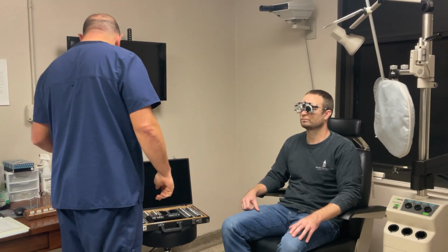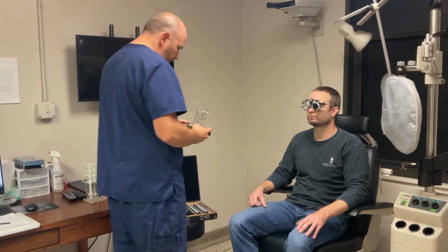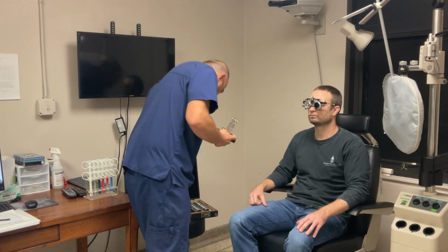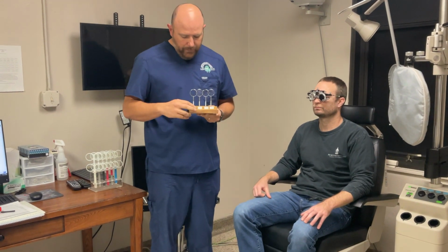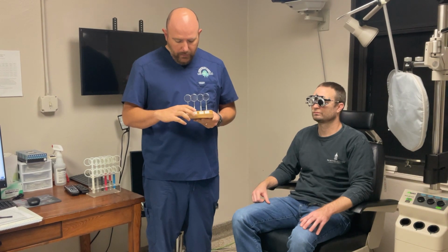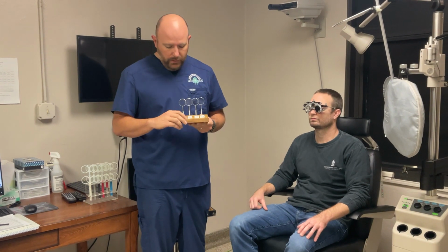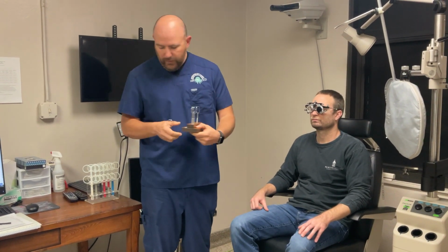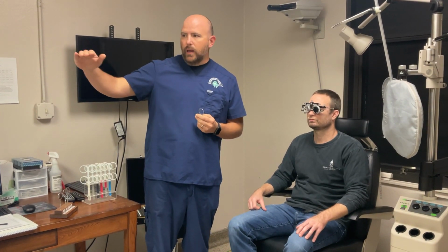I'm going to put my one diopter flipper back here in the rack. And now I'm going to grab my JCC lenses. Just like on the proficiency, you will have this rack here, or you will have your own JCCs that are going to be marked appropriately for the patient's visual acuity. Patient was 2100, so I'm going to grab the plus or minus 75 JCC flipper. Now we need to select a specific optotype. So we're going to stay at the same line of acuity. We're not going to change our optotype or our line or anything like that.